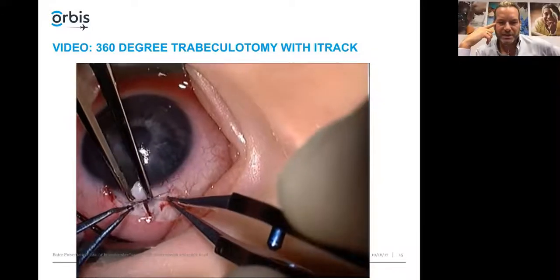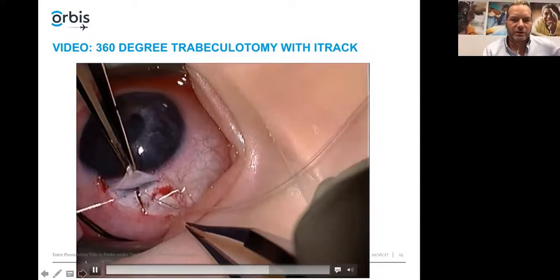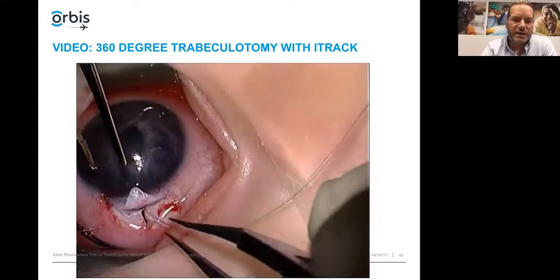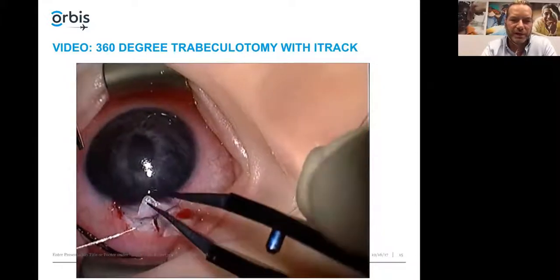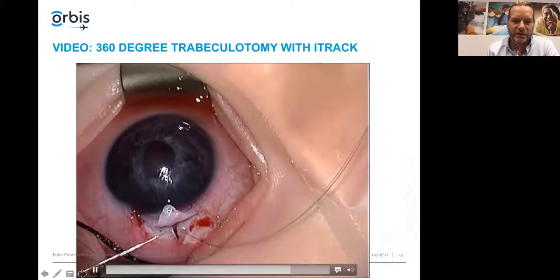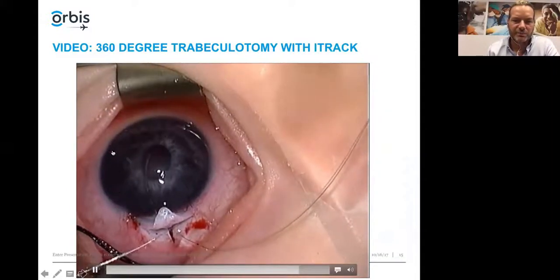I'm just going to grab it outside the incision. And I want you to direct your attention over here. As I pull this catheter, you start to see the catheter coming across the pupil and the iris there. You get a bit of a reflection off it, and it's right up here right now. So this side of the angle has already pulled through.